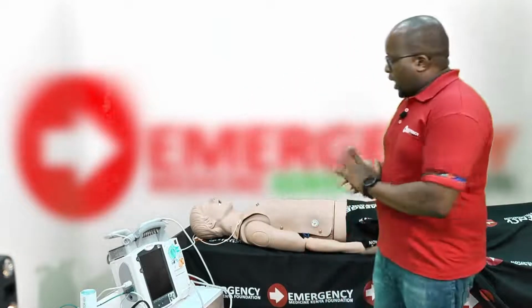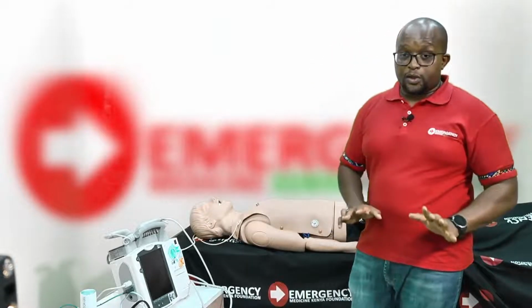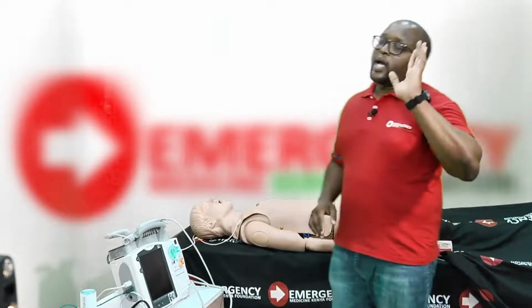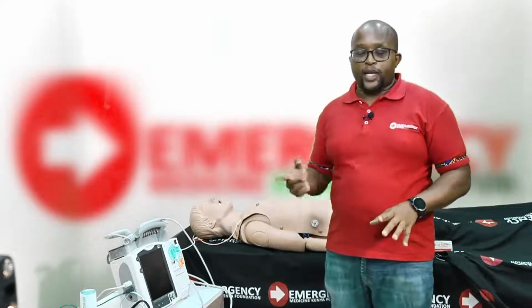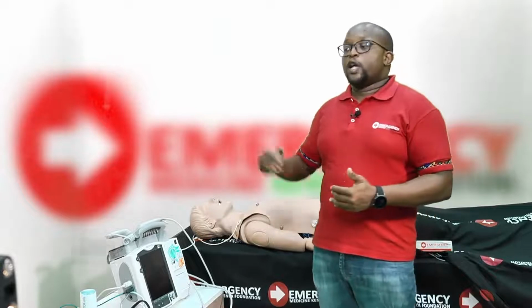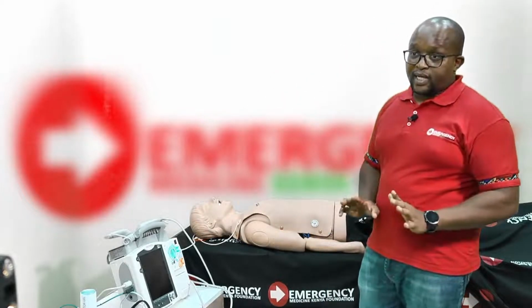So we have our patient here, and I'm going to show you how to quickly go through defibrillation. Remember, when you're doing CPR on a patient, you're normally going through cycles of CPR every 2 minutes, and at 2 minutes, you want to check the rhythm and shock the patient if indicated.